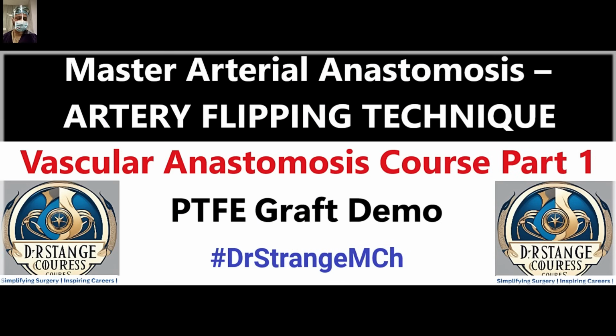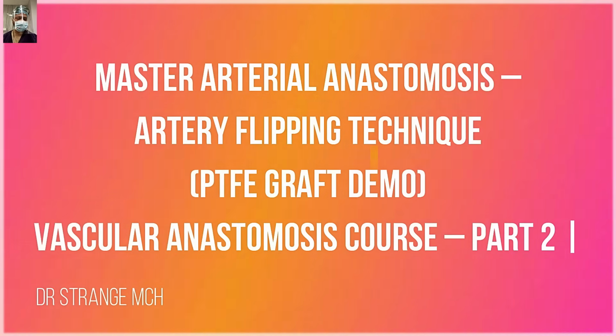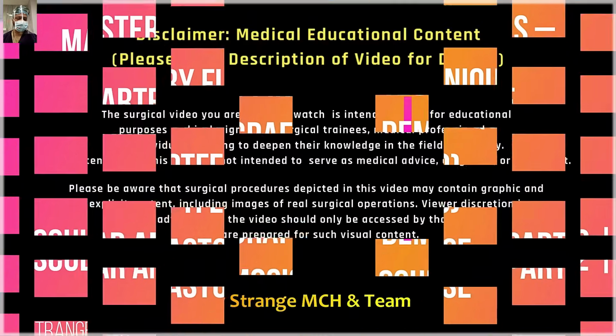Hello everyone, welcome back. So this will be the second part of the interrupted arterial anastomosis, and in this short video we will discuss the theory part briefly, followed by a demonstration of how to flip the artery in difficult situations.